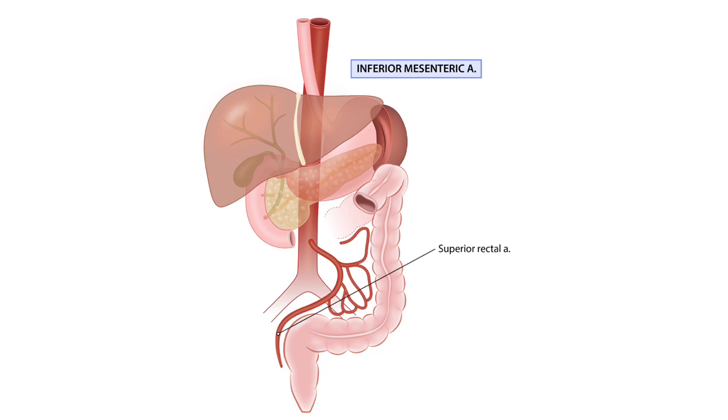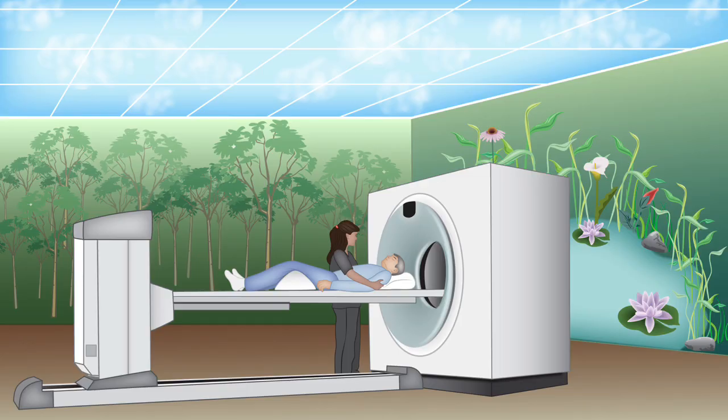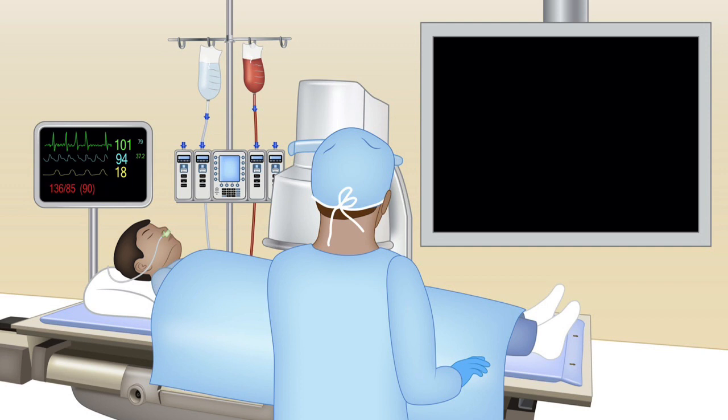So once you decide that the patient needs interventional radiology support, and depending upon the status of the patient, the radiology team may do an emergent CT angiogram to help them navigate the vessel that they need to focus on, especially if it is possible to do so. Sometimes it is not possible, and then they take them straight to angiography.